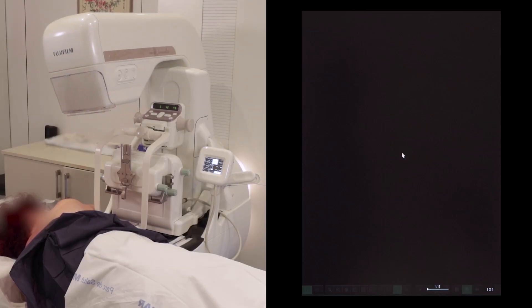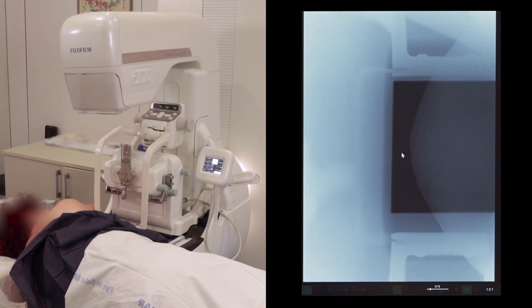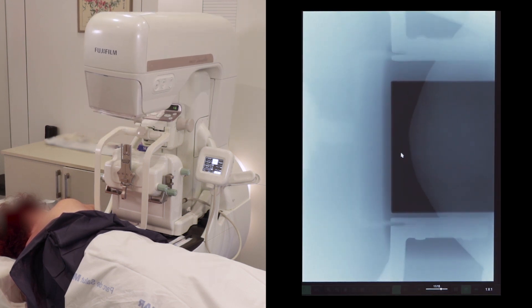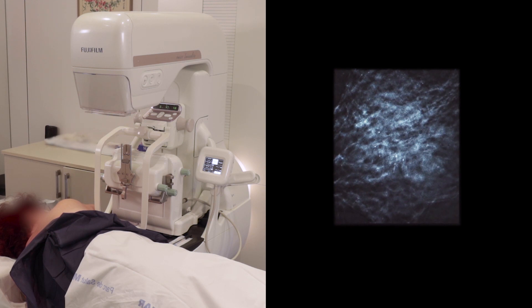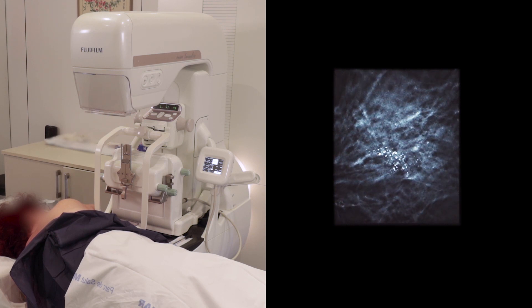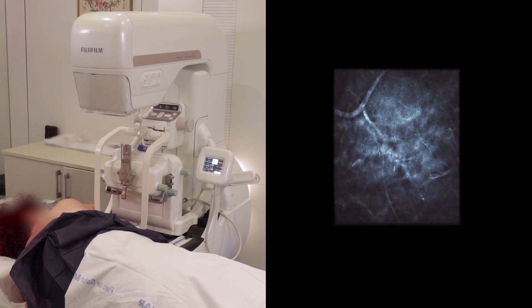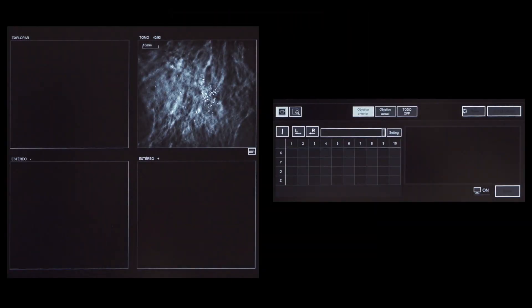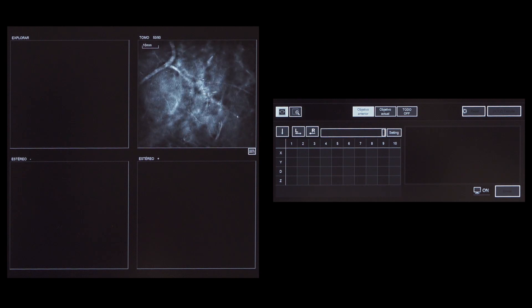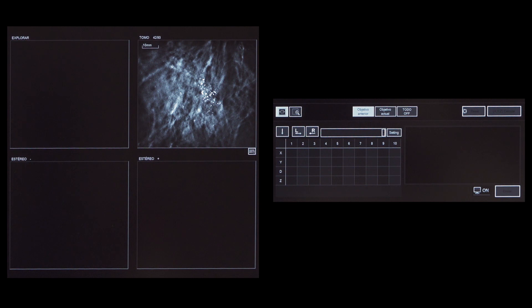Acquire a TOMO biopsy sequence. Raw projections are displayed, followed by the TOMO images. Scroll through the TOMO images to select the plane where the target is displayed. Select the target.